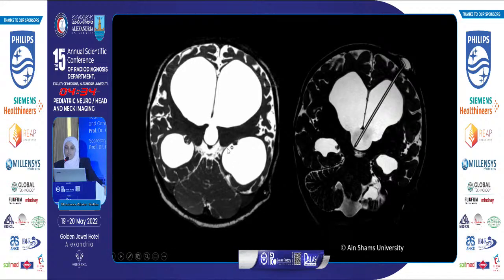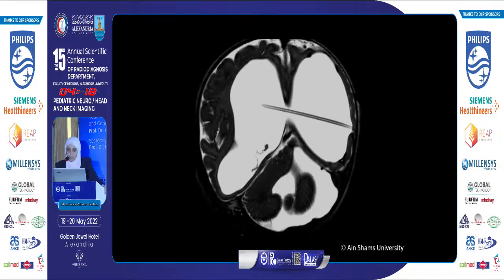This case came for shunt evaluation. We can see the shunt is nicely demonstrated. It's patent here, and the reservoir with no collections around the reservoir, no signs of failure, with clearly visible lumen of the shunt. So this is a patent shunt in its cranial portion. Also, another case showing a clearly demonstrated patent shunt here.